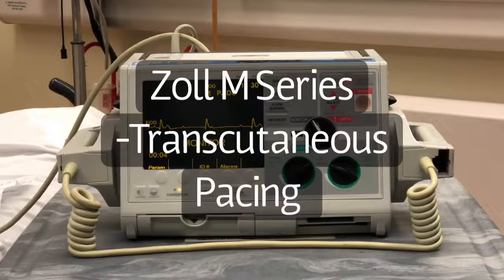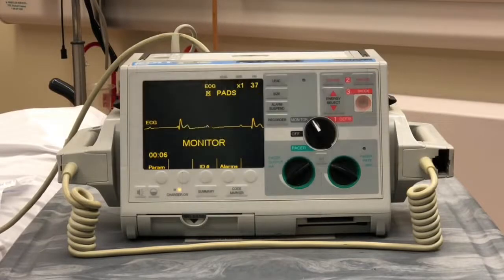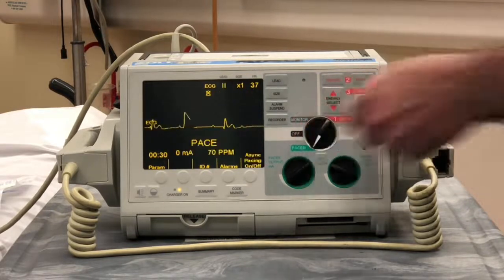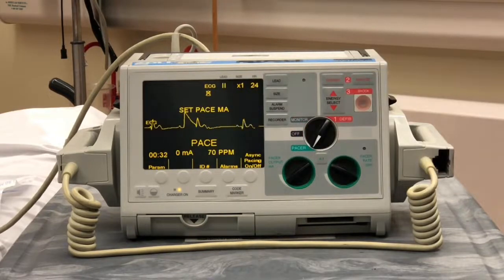Now we're going to use the Zoll M series defibrillator to provide transcutaneous pacing. And for our patient in an unstable 3rd-degree heart block, we've applied the pads to the patient's chest, and we've also applied the 3-lead ECG. We are going to turn our knob to the pacing function. And we see the green pacer and the 2 green dials.